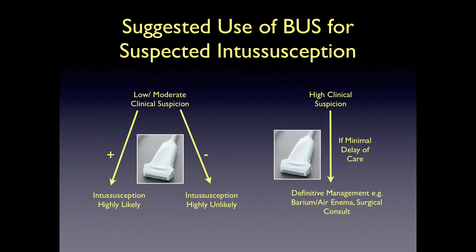On the other hand, if there's high clinical suspicion for intussusception, bedside ultrasound can be performed if there's minimal delay of care. Definitive management, such as barium or air enema, and surgical consult should be sought as soon as possible. Needless to say, the operator has to have a reasonable level of confidence in his or her bedside ultrasound skills in order to apply this algorithm.